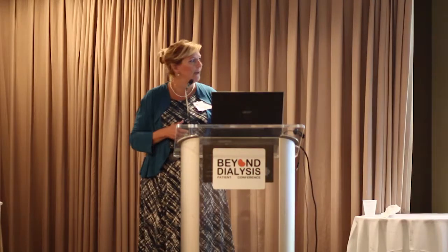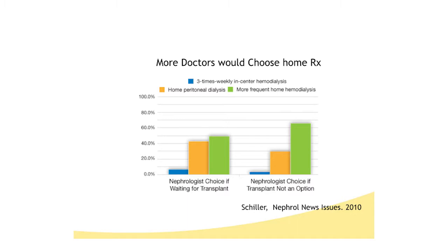And interestingly, as this slide shows, when they asked doctors this question, the majority of doctors, nephrologists, would choose home hemodialysis. Okay, interesting. And we'll come back to why in a few minutes, home hemodialysis.